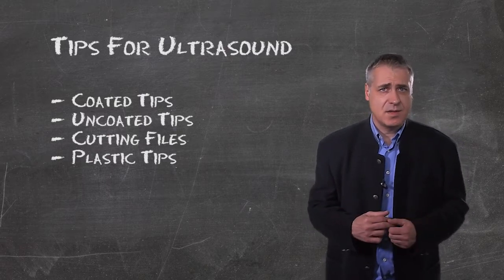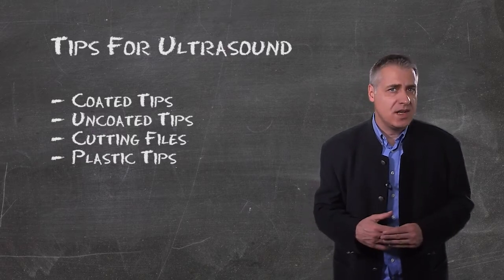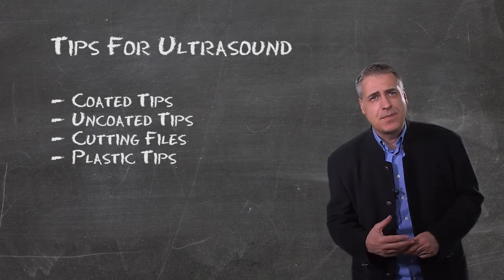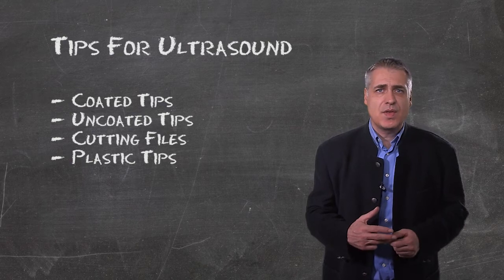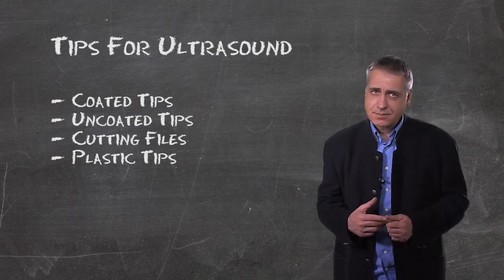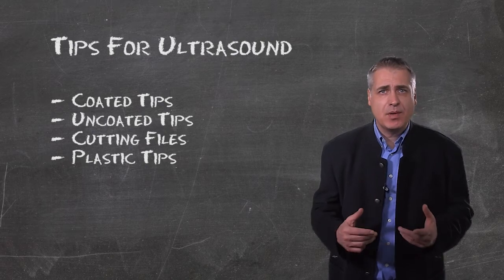Uncoated nickel titanium tips are more likely to be used for passive ultrasonic irrigation or for removal of broken instruments or to remove remains of cement or resin. Although they are uncoated, it is recommended to use them without contact to the canal walls while doing a passive ultrasonic irrigation.